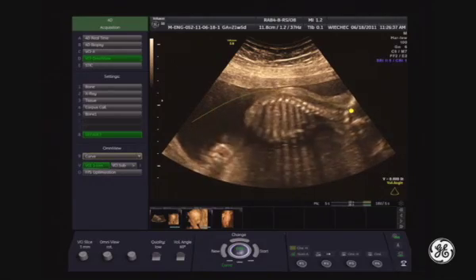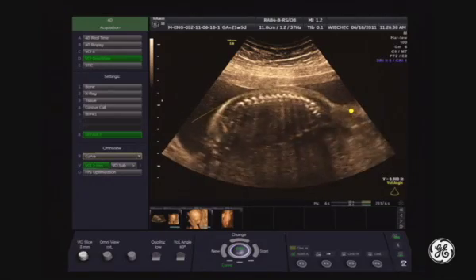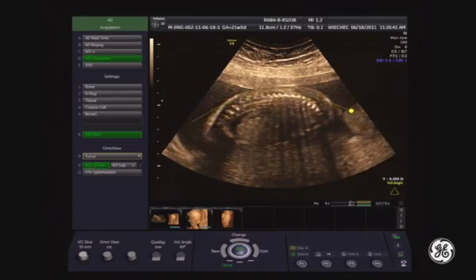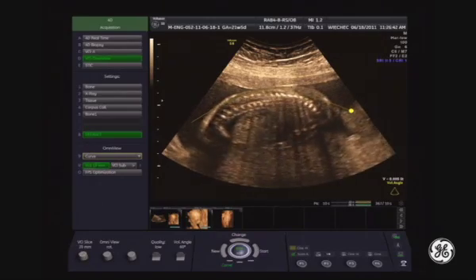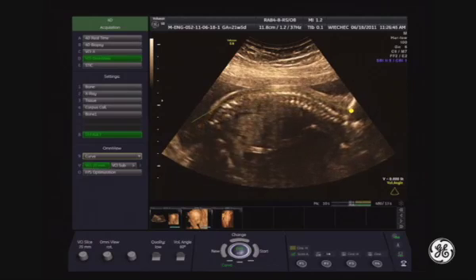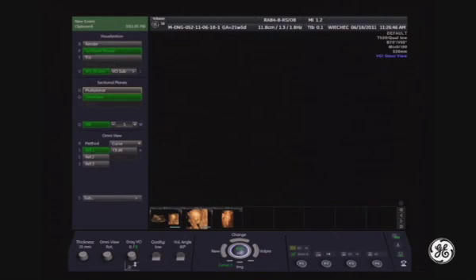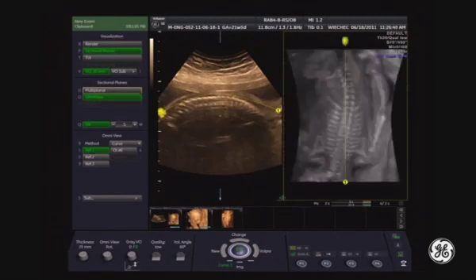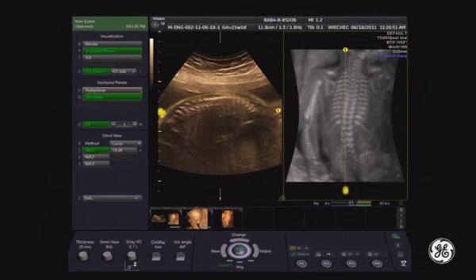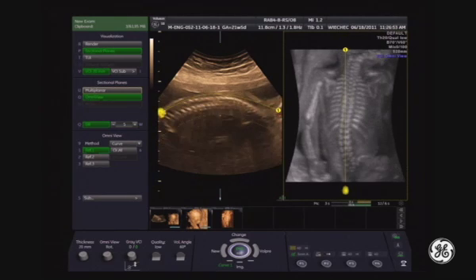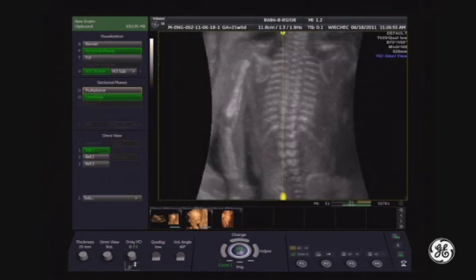I need to increase the slice thickness for my rendering to about 20 millimeters. When we are ready, we can start the acquisition. Here you can see the OmniView — this is the fetal spine in motion.